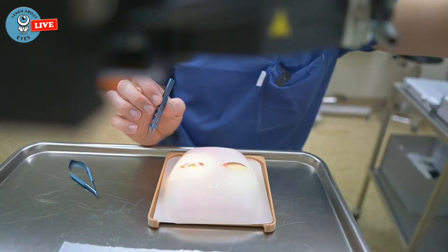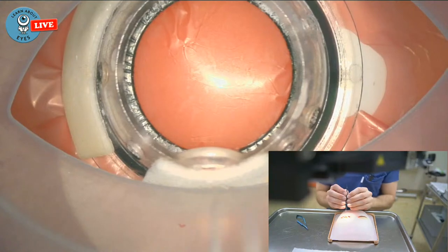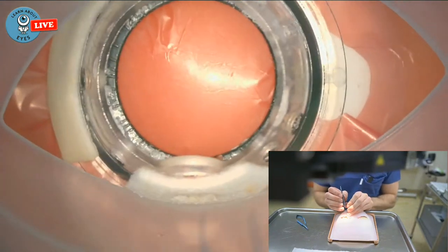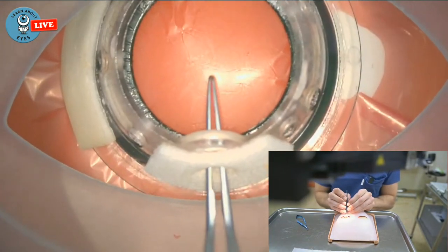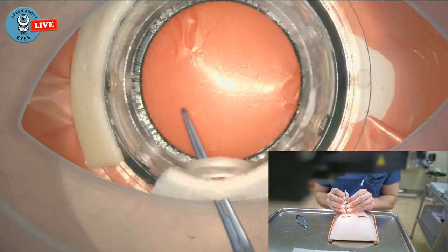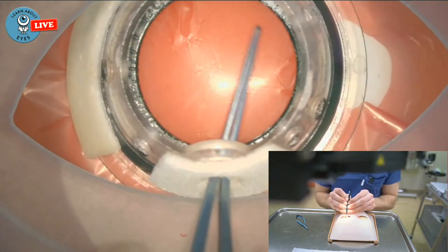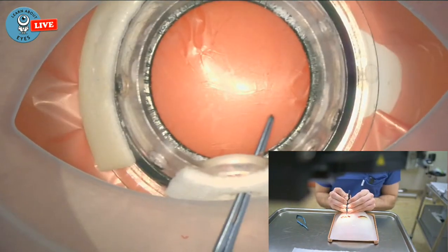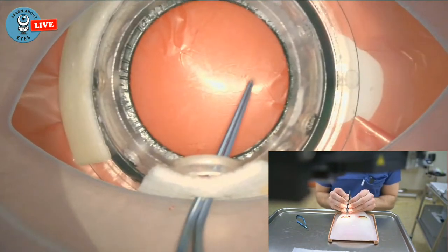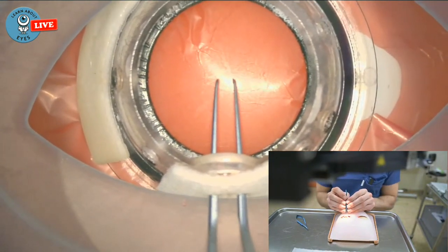And if I show you both views, I hope it's visible like that. If you go in, this is usually very tight here. Okay, if you go in, you can do a real circle just by moving the forceps between your fingers and pivoting. That works actually really well.